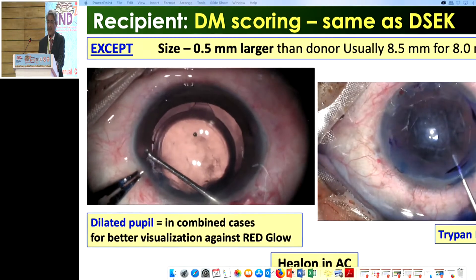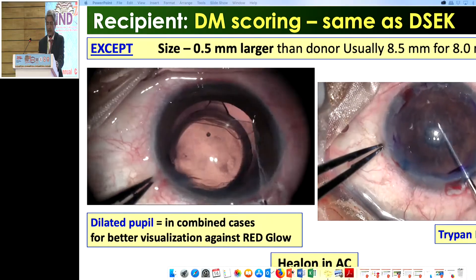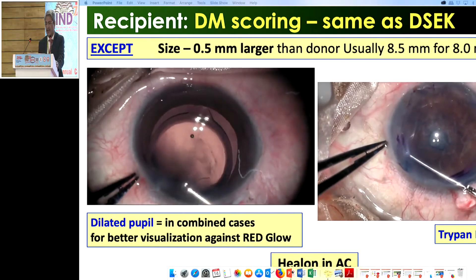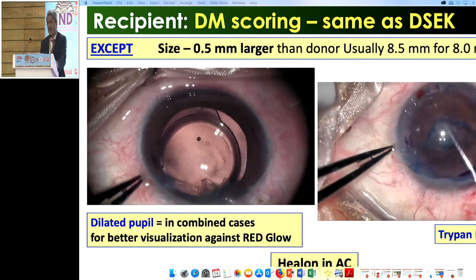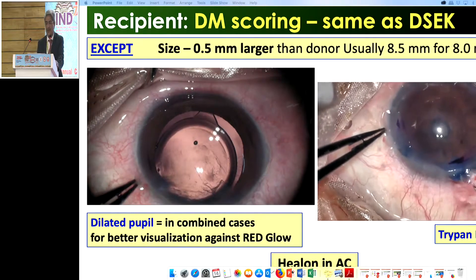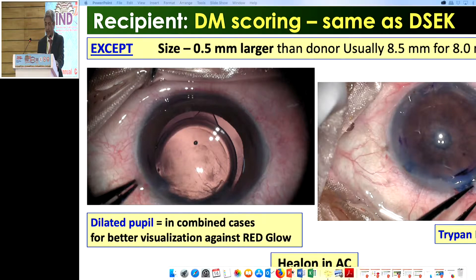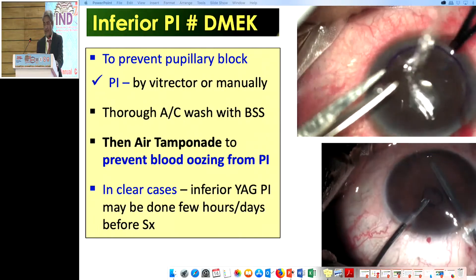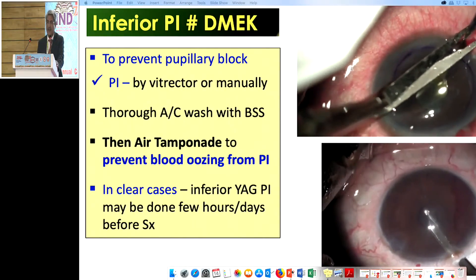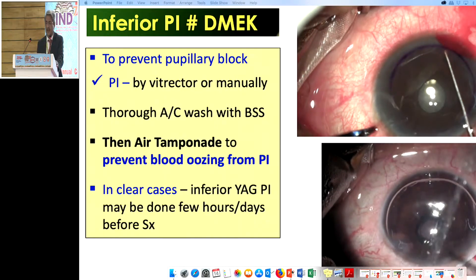For DM scoring, the diameter differs slightly between the two procedures. When visibility is poor — such as during a triple procedure — you can use trypan blue or air, especially in AC IOL or phakic patients where you don't want to put any viscoelastic. Some people use an AC maintainer during scoring. If you do use viscoelastic, use Healon because it can be removed completely. Performing an inferior peripheral iridectomy (PI) is a mandatory step, though a recent article suggests PI may not always be necessary. Because iris thickness varies, we generally perform one inferior PI to prevent pupillary block.